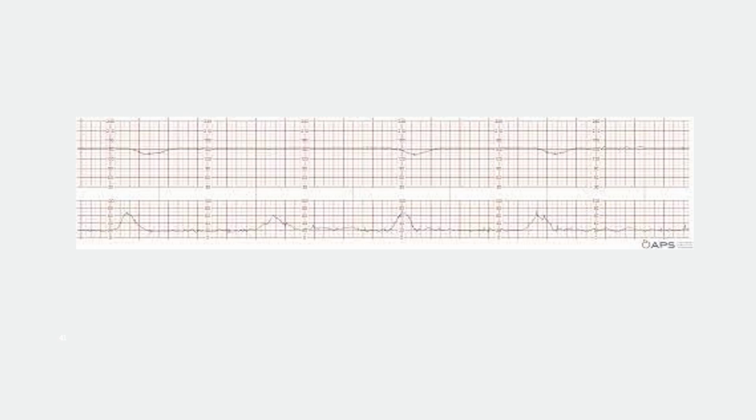One case that I will point out: you may have a patient that has a nice strip. Again, this is why you want to look and see what's going on before. You may have a patient that's been laboring, with a normal baseline, category 1, moderate variability, accelerations, no decels. And then the anesthesiologist comes in and gives that patient an epidural, okay? What happened? And you see this. You probably won't see absent variability though, but you might see minimal and you might see some lates.